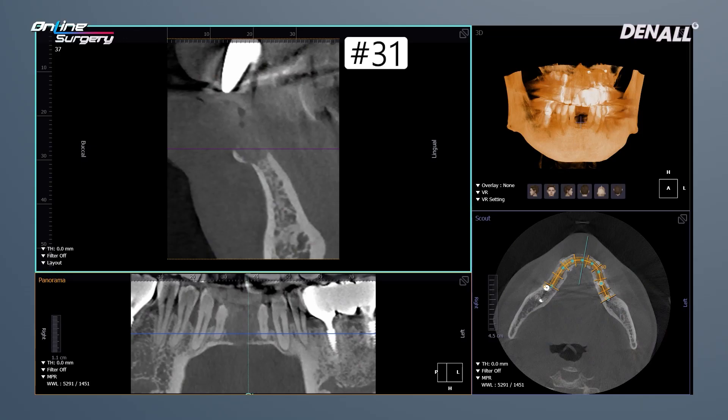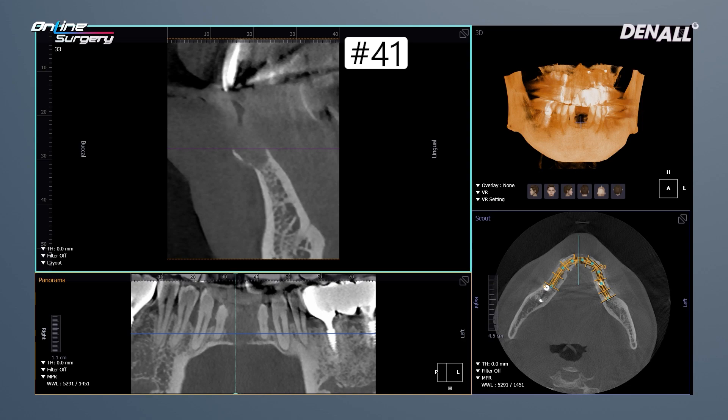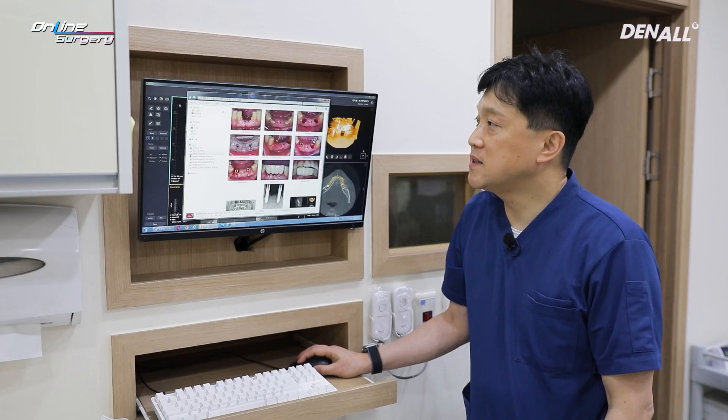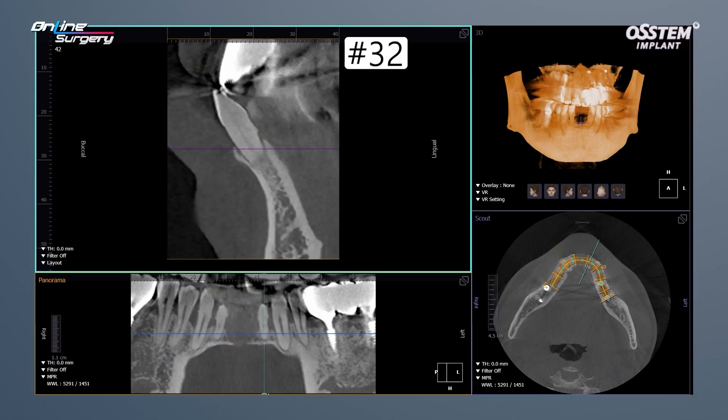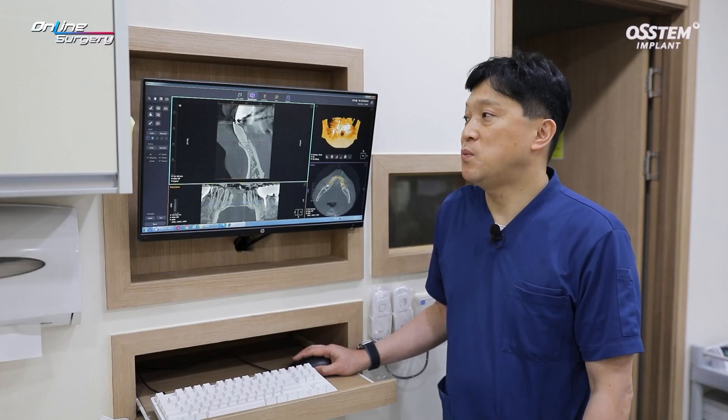If you look at the x-ray, this is the CT before surgery. Numbers 31 and 41 — you can see that extractions have been done but healing is not fully complete. Numbers 41 and 31 extractions were done, but the extraction sockets are not fully healed. In number 32, there is a very short root.